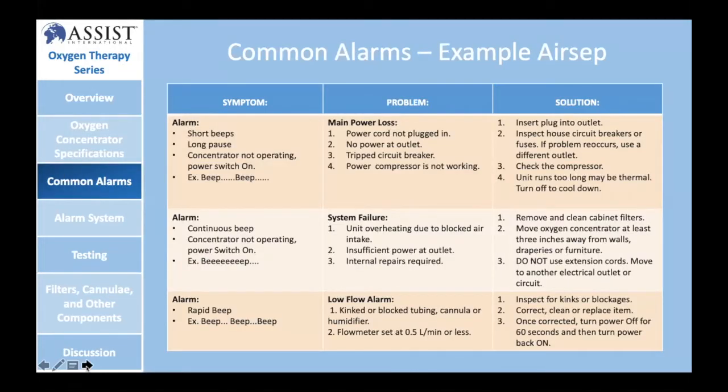So as a clinical user, you're probably wondering about some of the information Maz presented as it relates to pressure, the purity of oxygen that the device is putting out, all of the components of the device itself. And while we recognize that you are unable to perhaps go at an in-depth level and repair and troubleshoot an oxygen concentrator, we want to touch on a few key first responder type responsibilities that we can share with you, and you can consider applying this in your practice as you deal with oxygen concentrators.